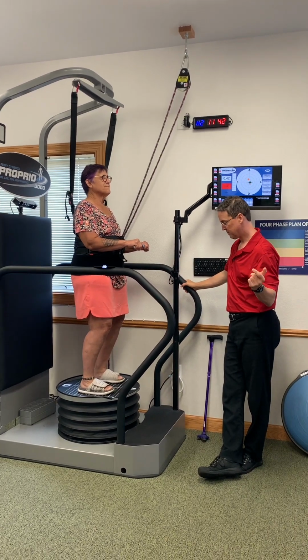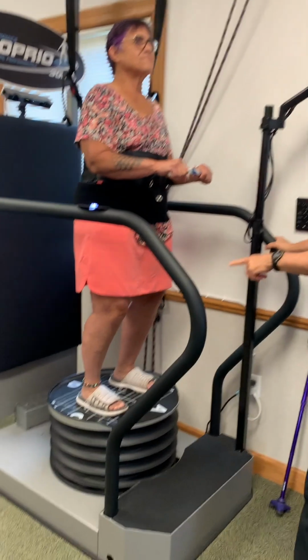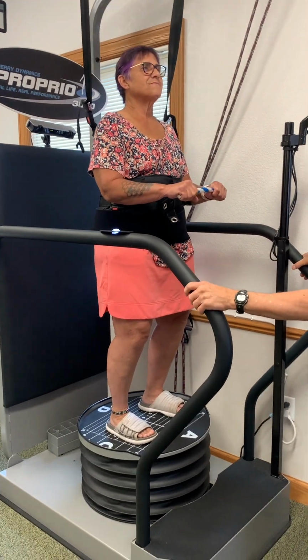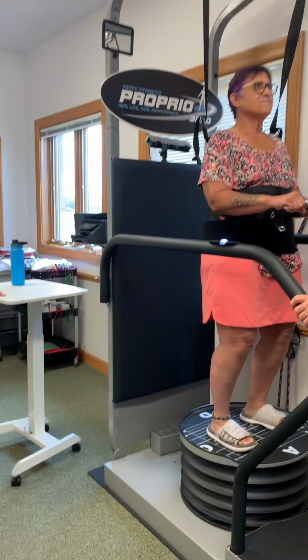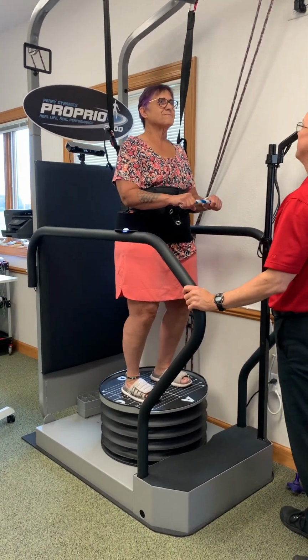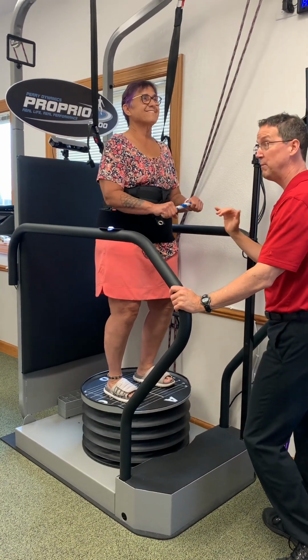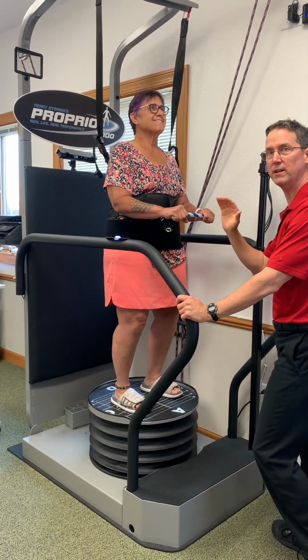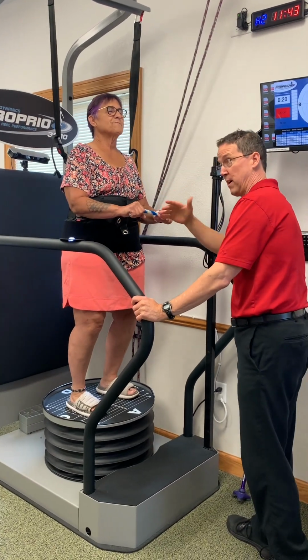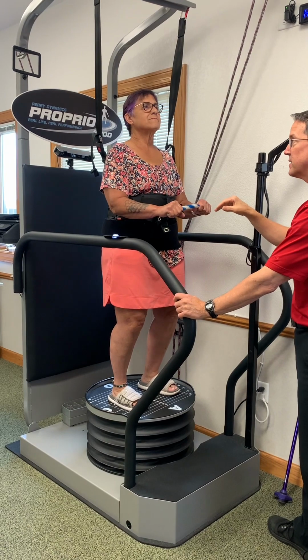I'm going to step in and see a little closer if you don't mind. She's kind of moving her knees, ankles, hips, that sort of thing. She's got about 34 seconds left for this setting. Would you say this is challenging? Yeah. Right? It's randomly moving. And we can design this so it's moving in all the directions. We could just select one dimension so we can individualize this.